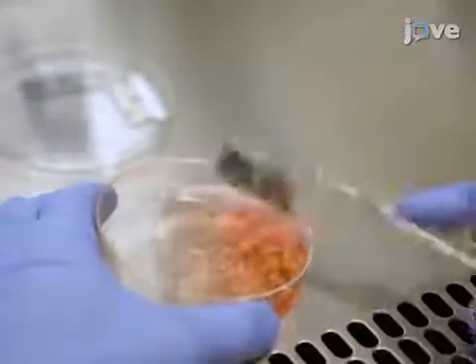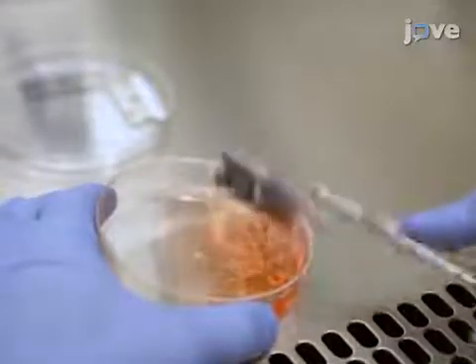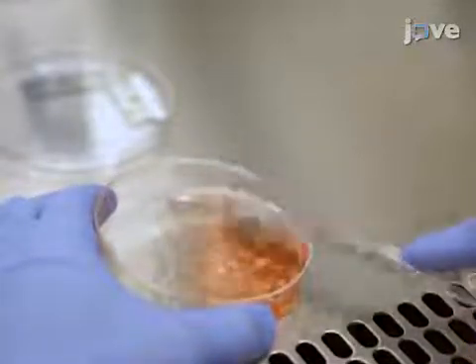Then, using the curved hemostats to grasp a razor blade, mince the tissue finely while removing the blood vessels or meninges. The final tissue fragment should be smaller than 1 mm. Afterward, transfer the tissue into a clean tube.